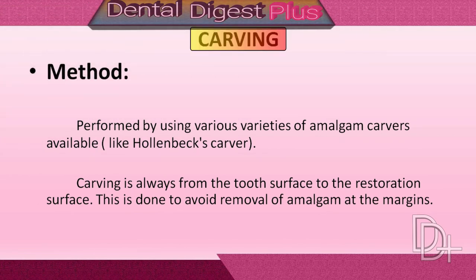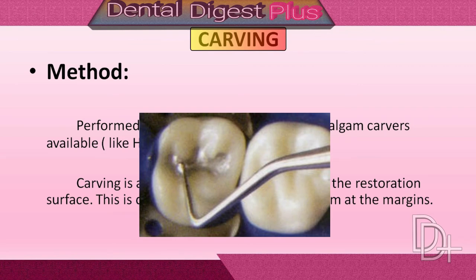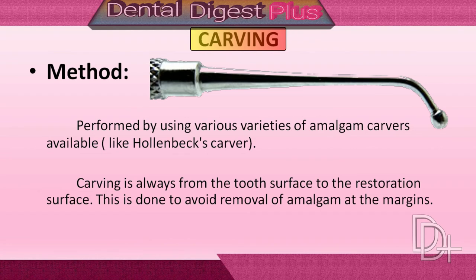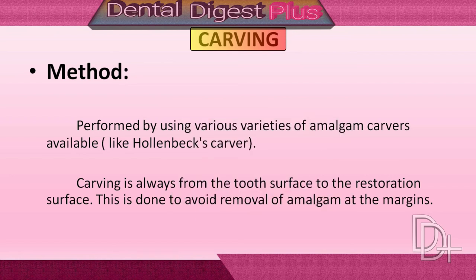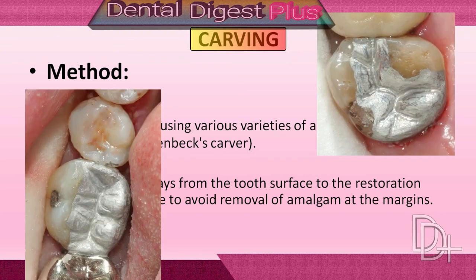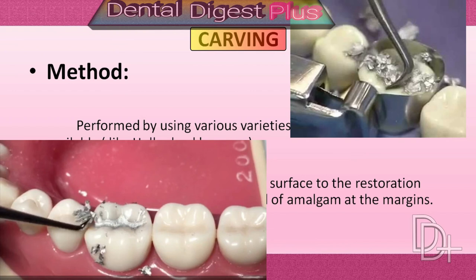Carving. Before starting carving of the restoration, pre-carving burnishing is carried out using a large ball burnisher for 15 seconds. Use slight force and move from the center of the restoration to the margins. This is a continuation of condensation and reduces the size and number of voids on the critical surface and marginal area. After the amalgam has been condensed into the prepared cavity, the restoration is carved to reproduce the proper tooth anatomy. Using remaining enamel as a guide, carving is carried out gently from enamel towards the center to recreate the lost anatomy of the tooth.